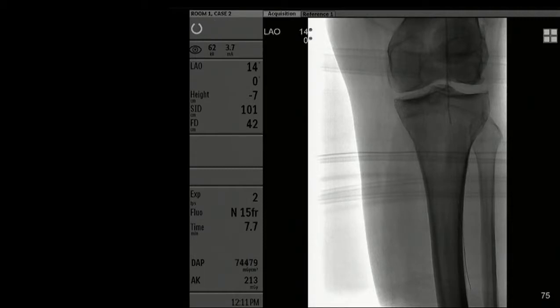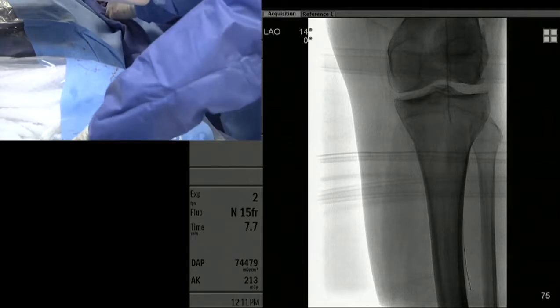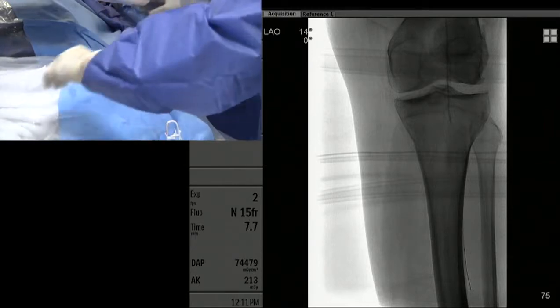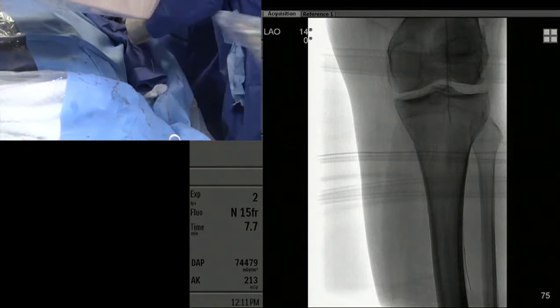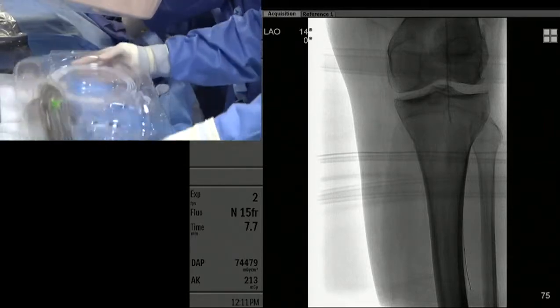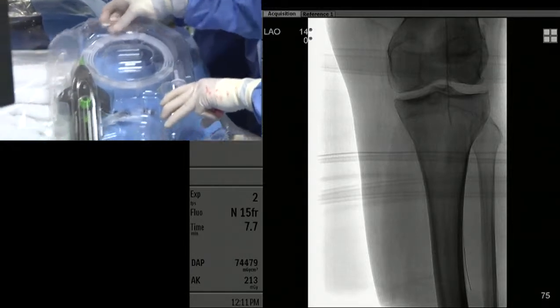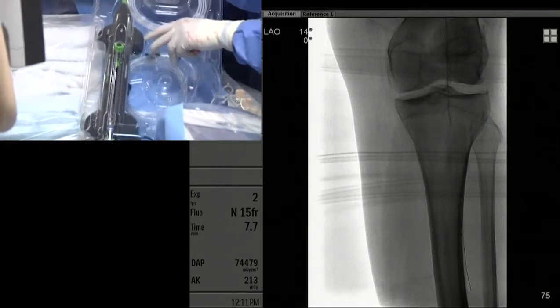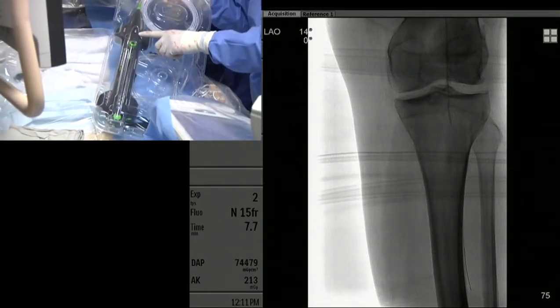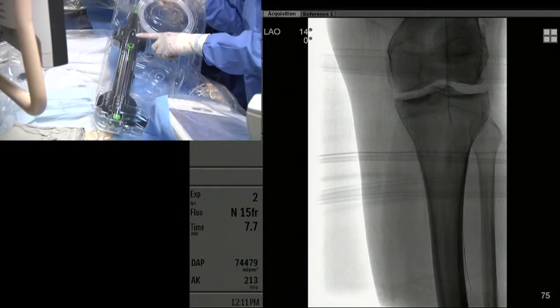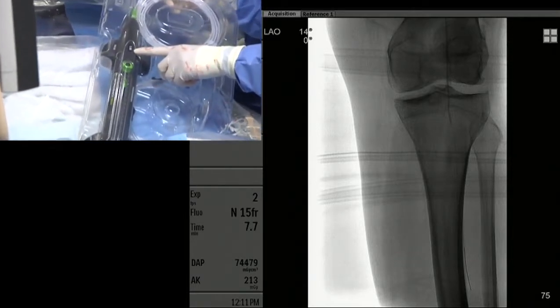Now we're going to exchange out our catheter and set up the CSI system. Exchange this out, leave this wire here. This is the 200-length CSI. For the SFA and popliteal artery, I chose the 1.5 solid version of this.